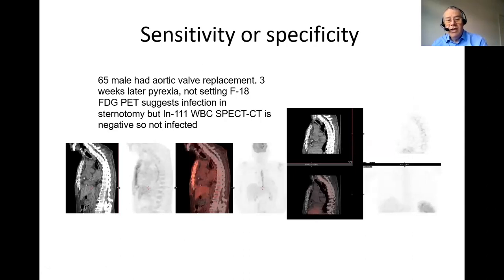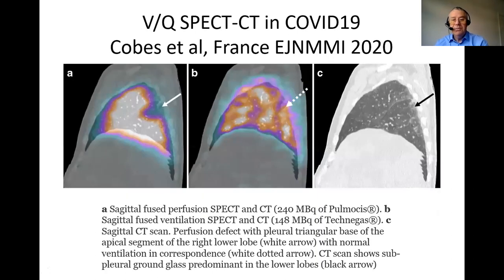So we did an indium white cell scan. It was completely negative. So they were reassured that this was just normal healing, and there wasn't an infection at that site. In fact, by the time they finished this process, the patient's temperature had settled.